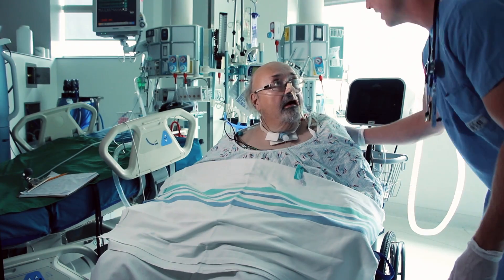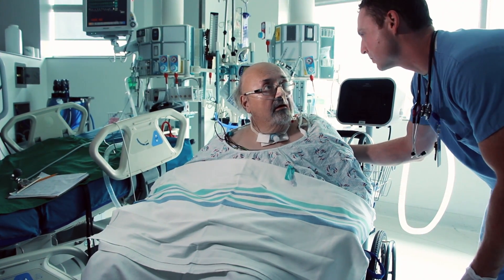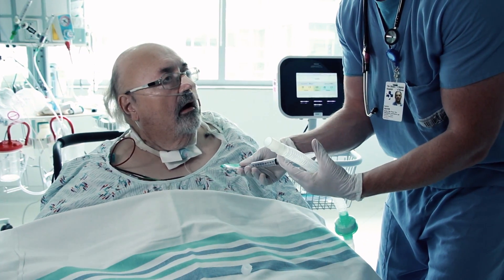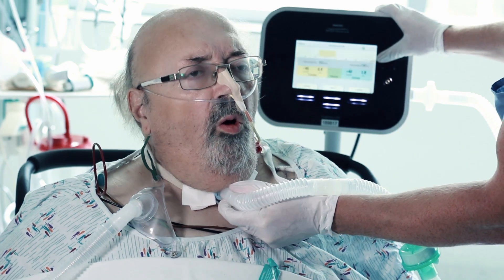Hi Chester, I'm Aaron, I'm your respiratory therapist. I'm here to assist with your cough to clear your secretions. When a tracheostomy is in place, it is best to perform MIE with an inflated cuff to minimize leak and enable the chest to reach therapeutic pressures.